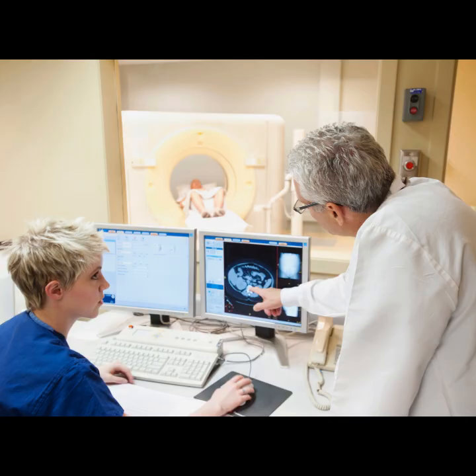If we look at the raw time savings achieved, where this kind of numeric correction might allow for, say, a near 10-fold reduction in overall scanning time needed for a certain quality of volume, the clinical gain is potentially immense. We are balancing acceptable noise levels against dramatically reduced scan times, which improves throughput and, importantly, patient comfort. Scan time reduction is irrelevant if the resulting waveform violates the laws of physics or the limits of the hardware.